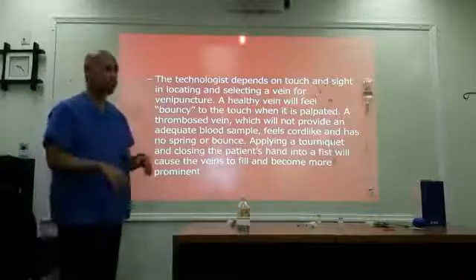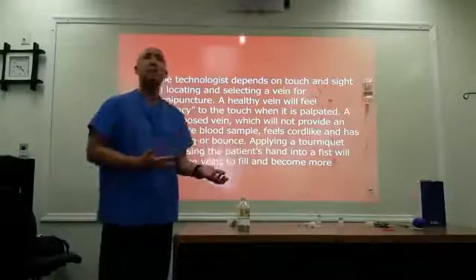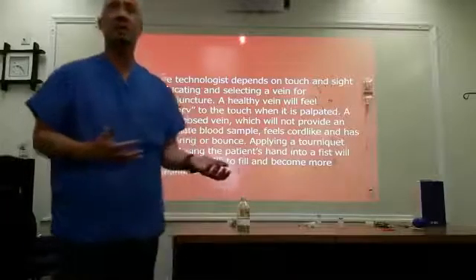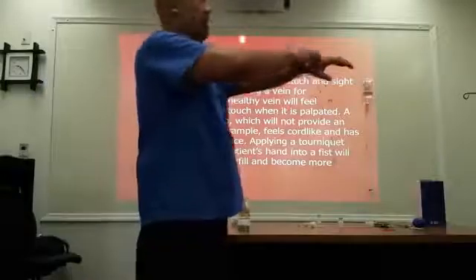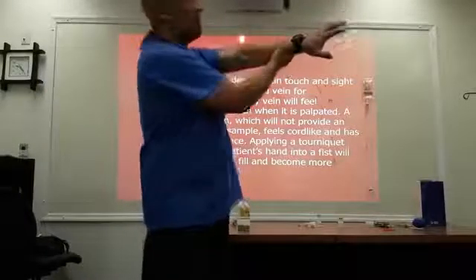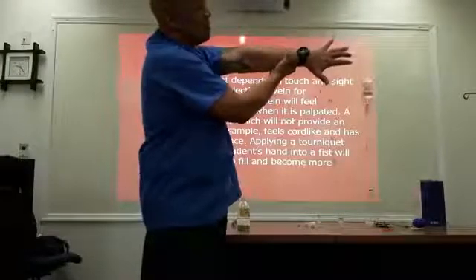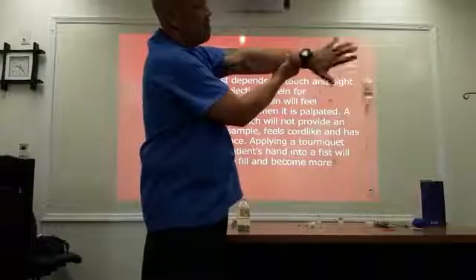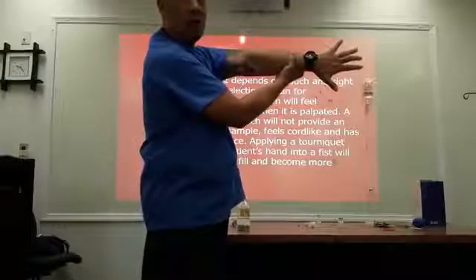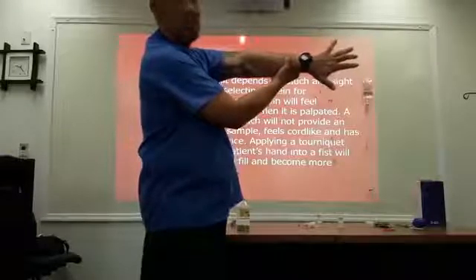Putting on a tourniquet. The tourniquet is going to be placed slightly above the area of the access site. If I'm doing a wrist or a hand, I'm going to tie the tourniquet around here. The whole purpose of putting on a tourniquet is that it causes your veins to plump up. Okay? What we're also going to do is probably pump the fist a few times to cause the veins to be even more prominent. Okay? Because we're increasing venous pressure in there.